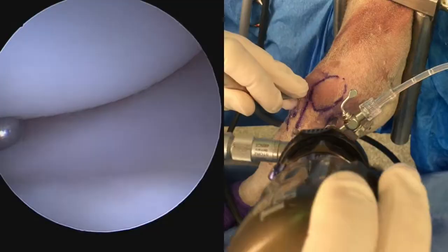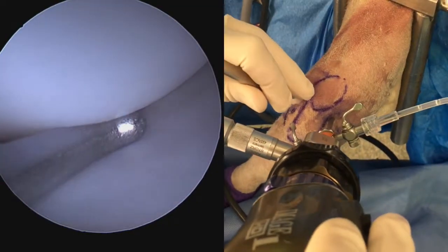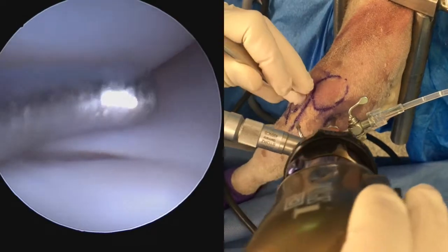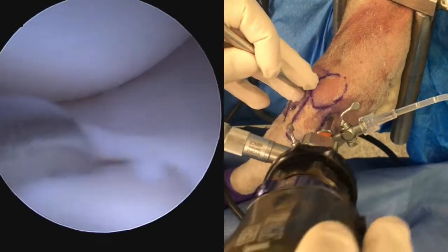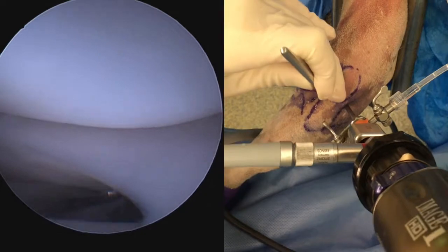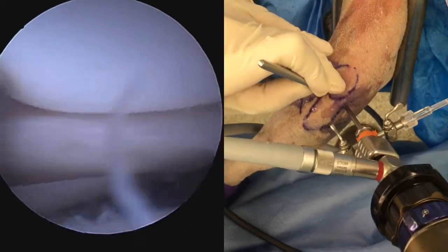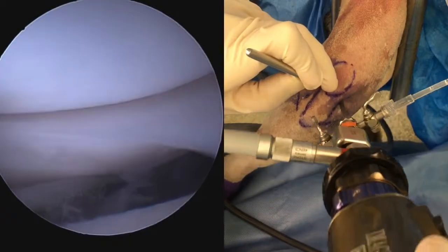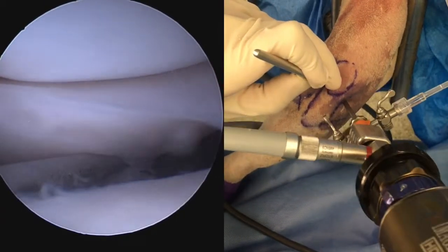For the lateral side, we have the stifle in slight flexion and varus. Triangulation and manipulation of the meniscus is a little easier in the lateral compartment because it's more mobile and distracts more readily. Again, we're palpating both surfaces of the menisci, trying to see if we can plunge into a tear.